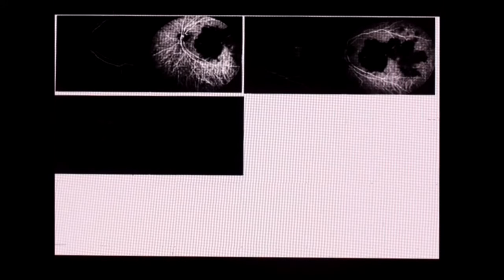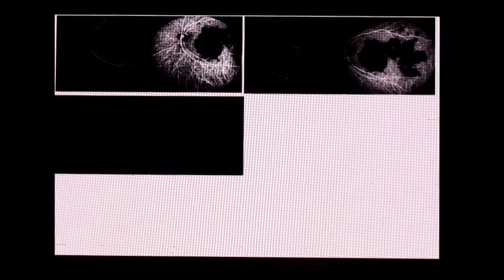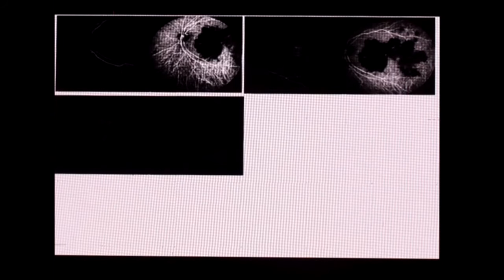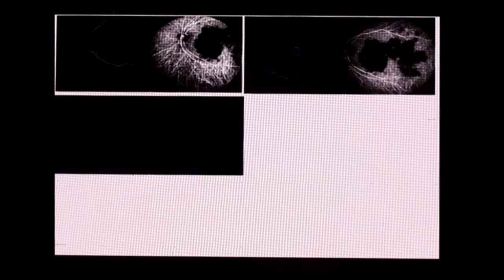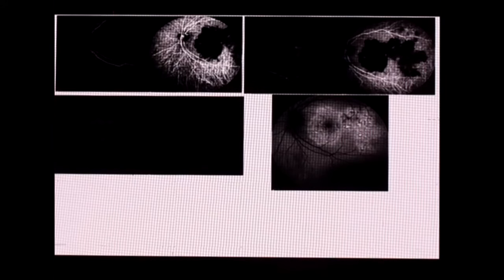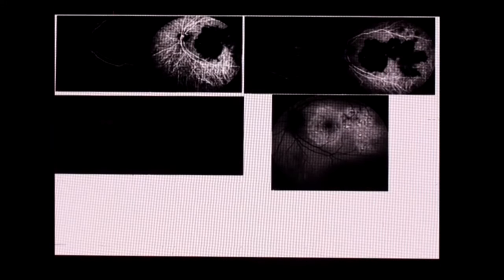In macular serpigenous-like choroiditis, you have hypo lesions on the fluorescein angiogram initially, and then they start showing late staining. Towards the edge you have hyperfluorescent fuzzy lesions in active stages. Autofluorescence is now an important modality for following up these patients, showing healing versus active lesions, helping guide treatment.